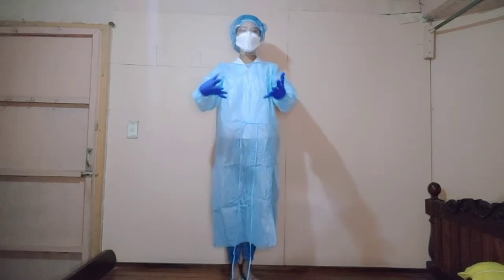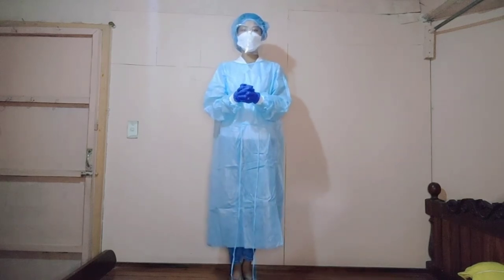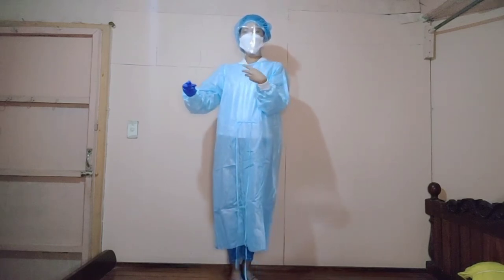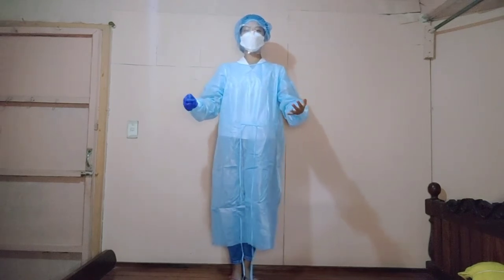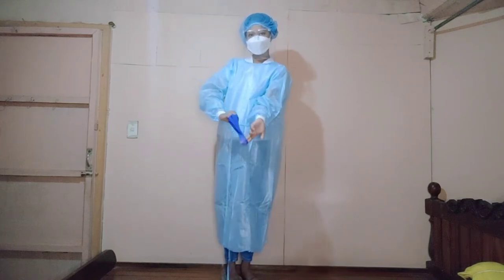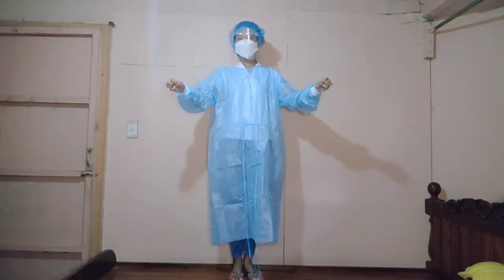After untying the front, we need to remove the soiled gloves, since they are considered one of the most exposed and dirtiest parts of the PPE. Grasp the palm part and remove the first glove, inverting it so the inside is now on the outside. For the ungloved hand, use two fingers to slide inside the second glove — inside, not outside — and remove it. Disposable gloves are disposed of since they are soiled and not reusable. It's called disposable for a reason.